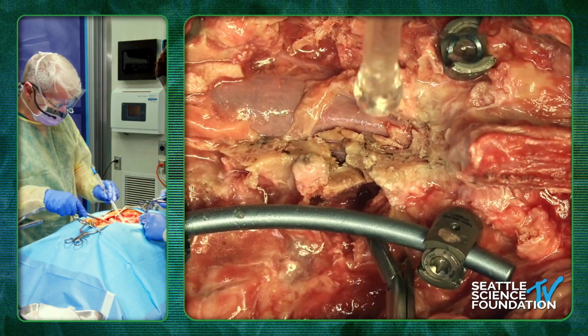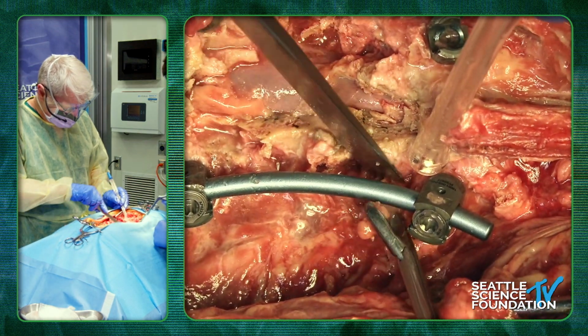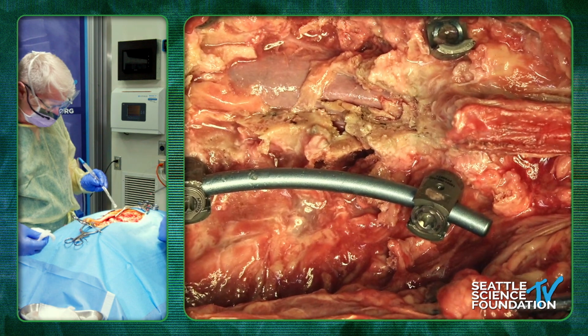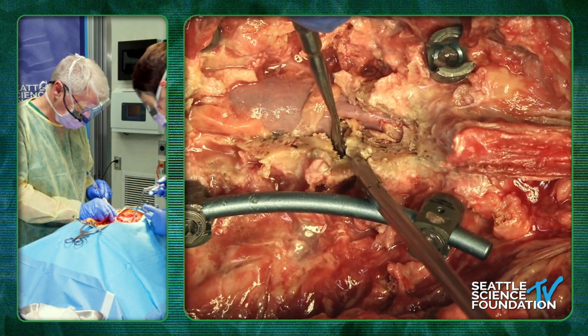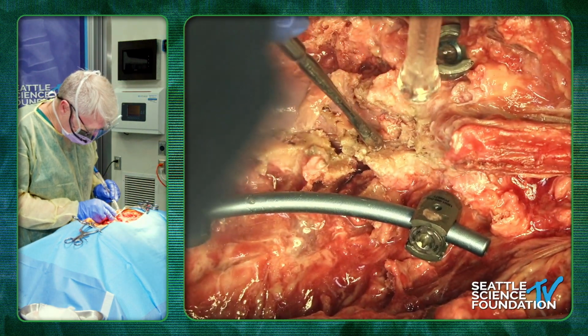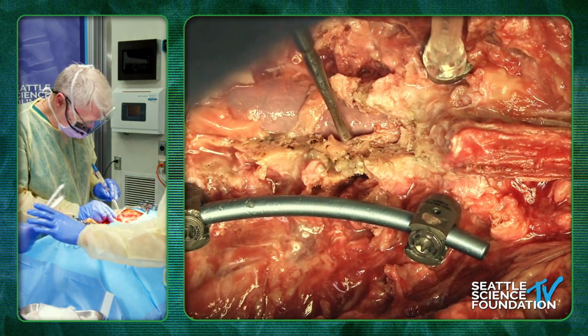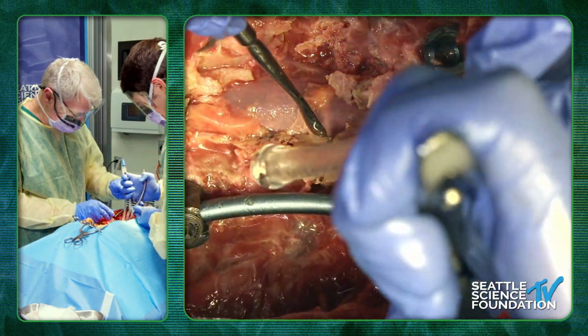So that's the superior facet completely detached off. It gives you a significant foraminal decompression, and it's completely relieved off your pedicle. And to me, that's all I need for a Smith-Petersen. So take this off too. You got it? Perfect. Okay. Like so. And then just take this off here. And I try to leave the inferior facet.